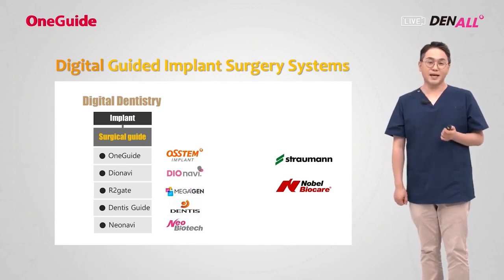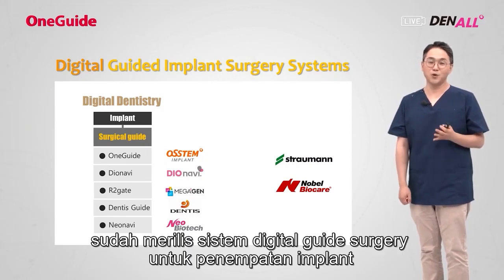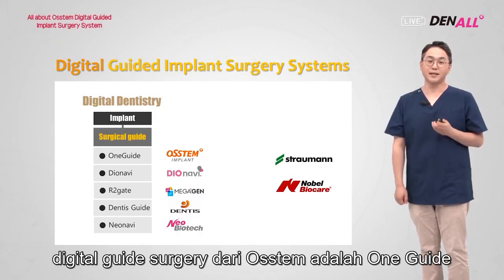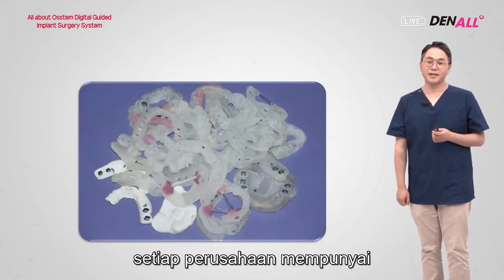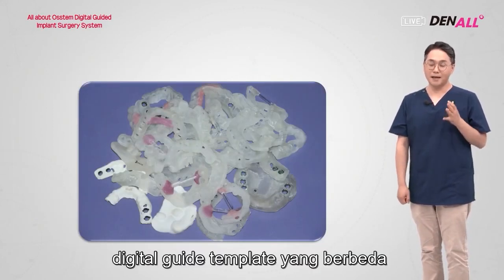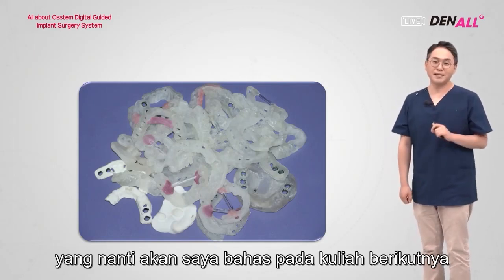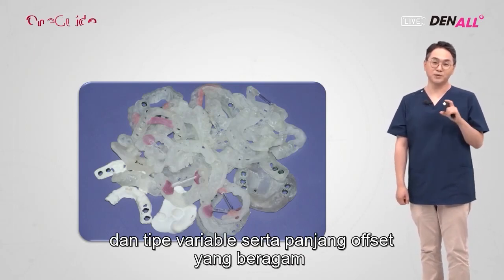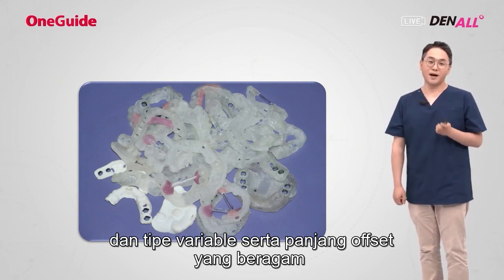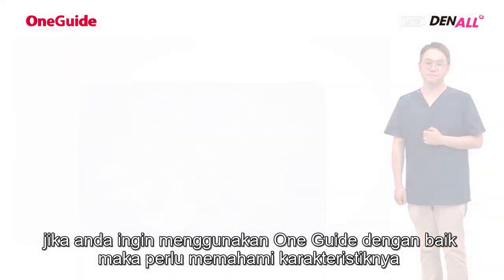As mentioned earlier, digital is all the hype. So all implant companies have launched a dedicated digital guide implant surgery system for implant placement. Osstem's digital guide surgery system is OneGuide. Each company has a different digital guide template. Some have a metal sleeve, some have an offset, which I'm going to mention in the next lecture. Offset has a fixed type and a variable type, and offset length is all different. If you want to use OneGuide well, you need to understand its characteristics.